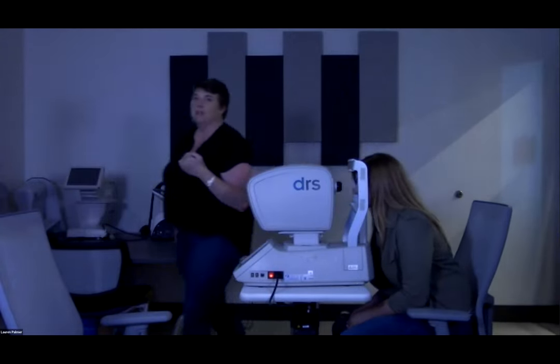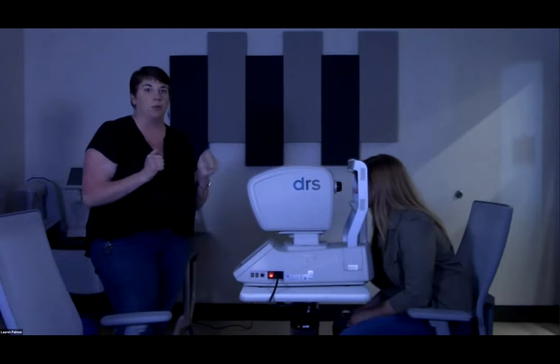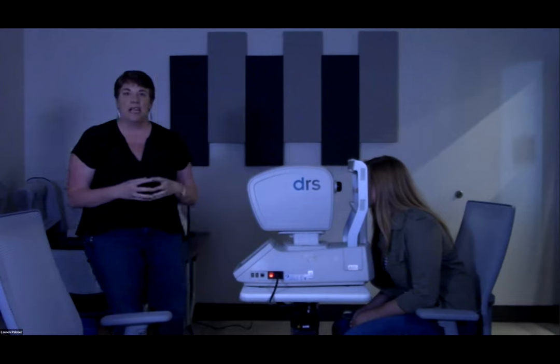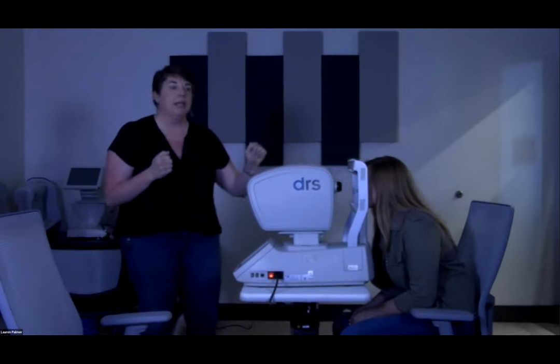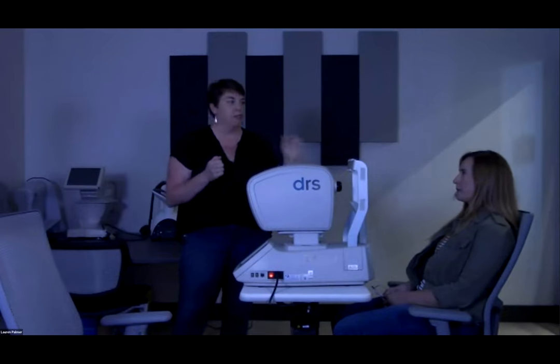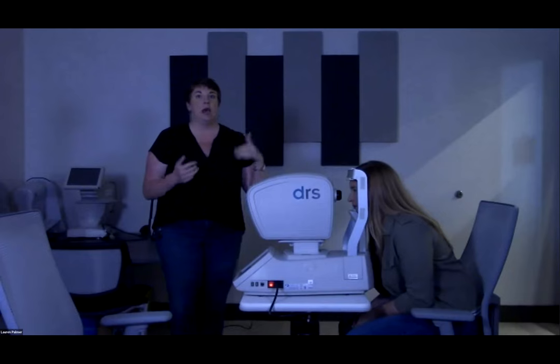A lot of times patient height is going to be the first thing that you want to adjust for. So we want to make sure that the table is an appropriate height. I'm noticing Rebecca's kind of having to strain a little bit to get into the camera. One thing that you can use as a marking point is to make sure that the forehead rest is eye level with the patient. When I look at Rebecca, I can see that this table is too high. So I'm going to go ahead and lower it slightly. And now Rebecca can comfortably come forward.